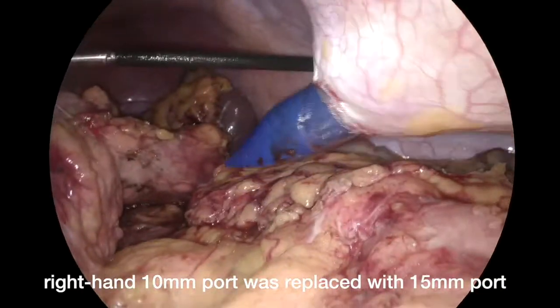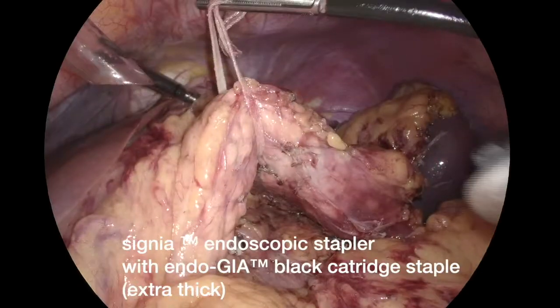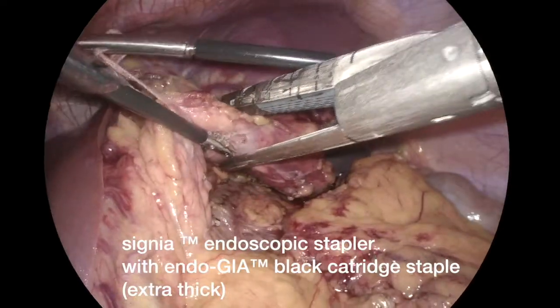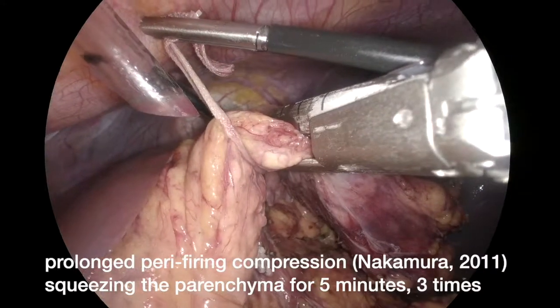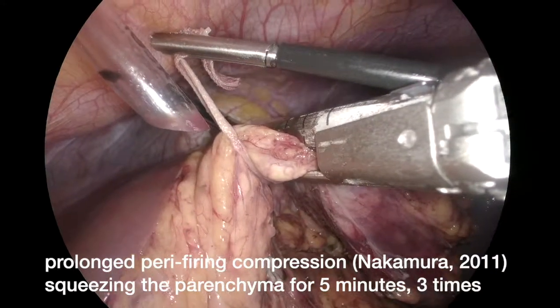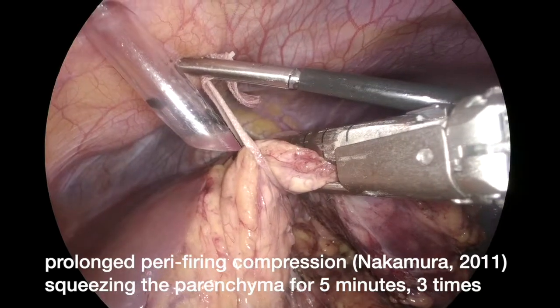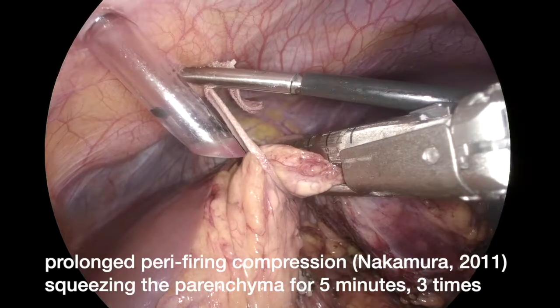The 10 mm port was replaced with a 15 mm port. We used the Signia endoscopic stapler, together with the extra thick black cartridge staple. To prevent postoperative pancreatic fistula, we applied the prolonged peri-firing compression technique as described by Nakamura in 2011.